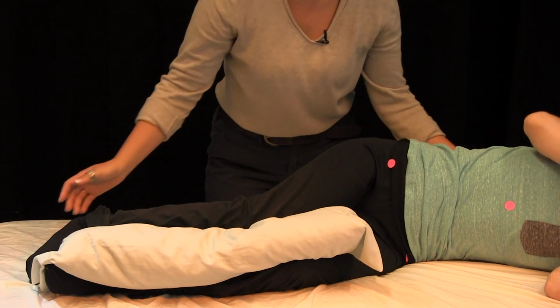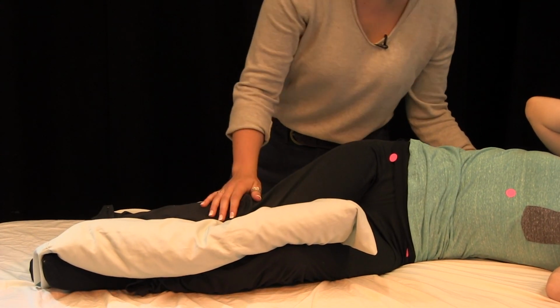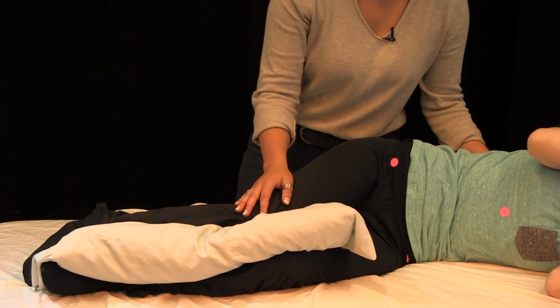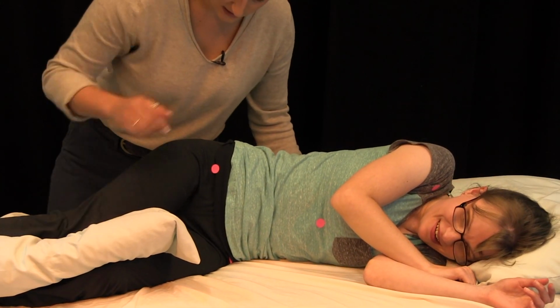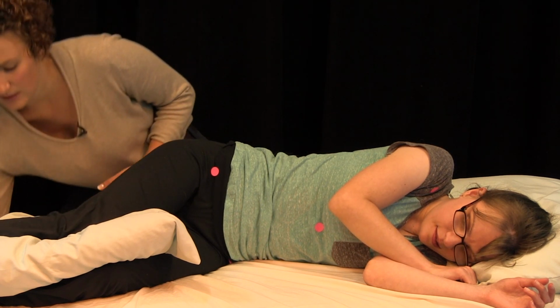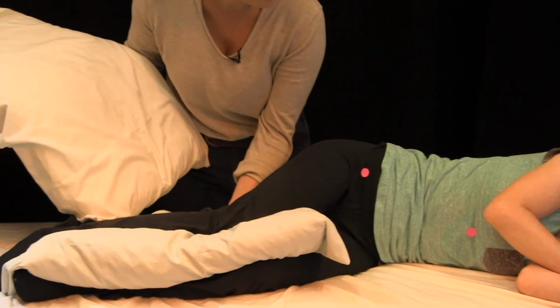And how does that feel? Do you think you need another pillow? Yeah, I'm kind of feeling like we're falling over, or not like we're gonna fall, but you know. Okay, not quite comfortable. No. And as we can see here, this hip is still adducted and the knees are coming close to each other, so we will add another support between the legs. Here we'll take a second pillow. Ready? Yep.